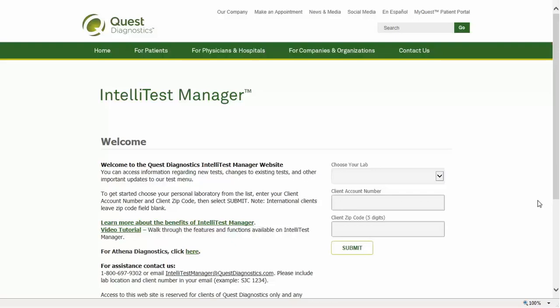Welcome to IntelliTest Manager, a flexible online portal that gives you access to new offerings, information, and test updates from Quest Diagnostics. This demonstration of IntelliTest Manager will provide you with an overview of the application.